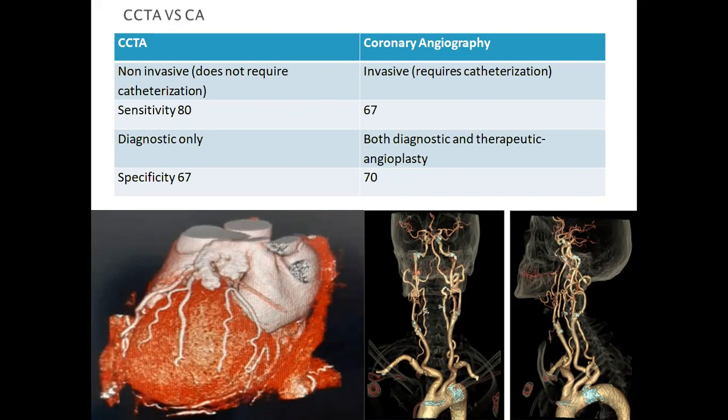However, it's only diagnostic, but the traditional coronary angiography will also sometimes involve therapeutic factors, because the person doing it can, right there when there's a pathology, perform corrective measures. The coronary angiography also has a very good resolution. If you can see the image on my right here, how the vessels are appearing, the visualization of the vessels is excellent. You can even see the tiny, tiny small vessels there.